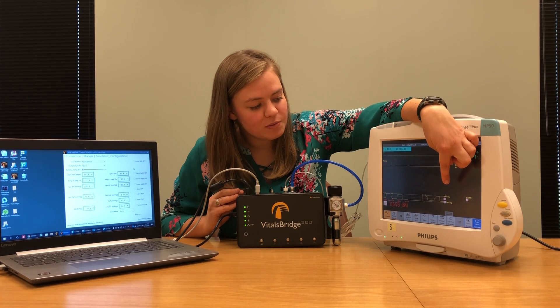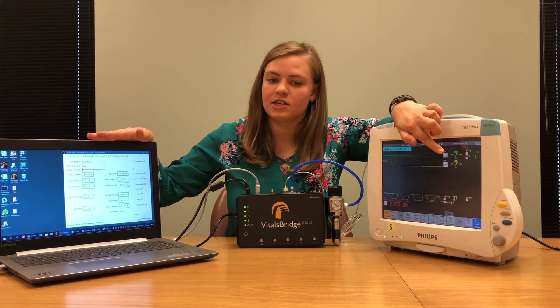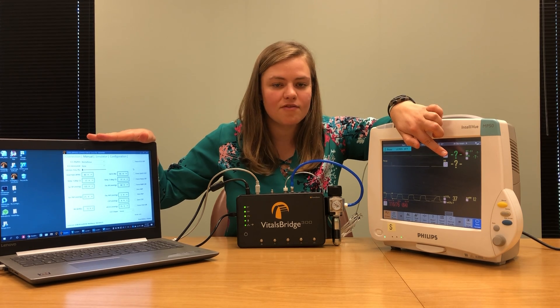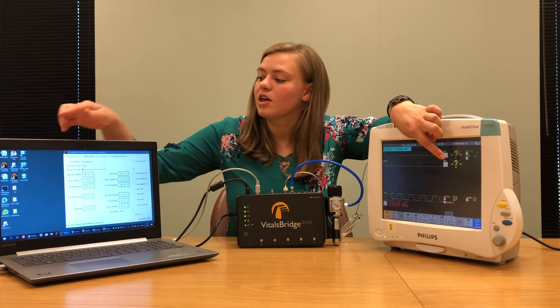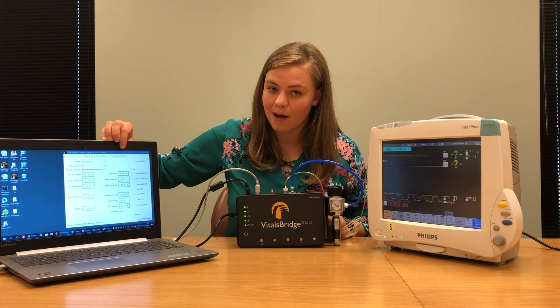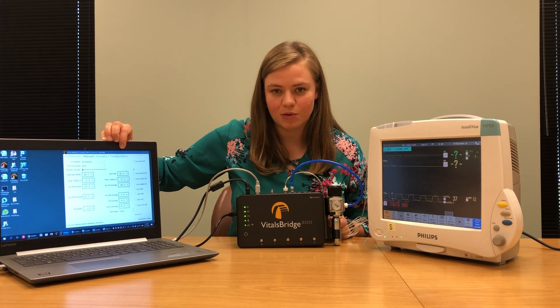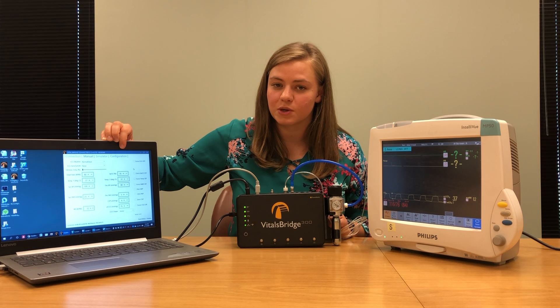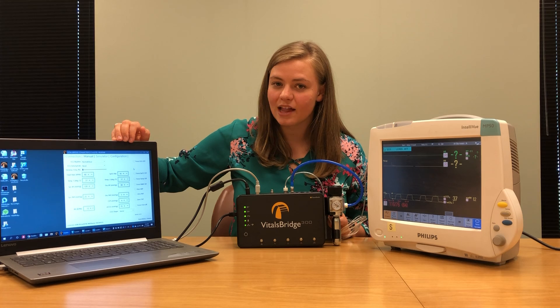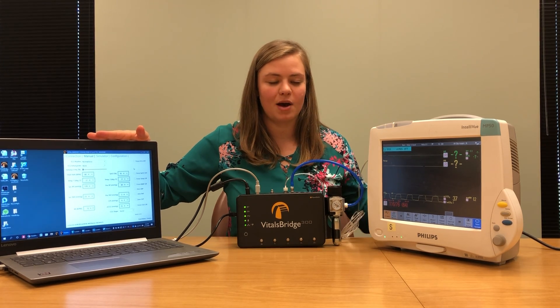After just a moment, you will also begin to see an ETCO2 reading. That ETCO2 reading should match the ETCO2 reading you put in on your VitalsBridge software. If after about five minutes those two numbers don't match closely, go to the configuration tab in your VitalsBridge connector software and perform a carbon dioxide calibration. Instructions can be found on VitalsBridge.com/downloads. Once calibrated, your ETCO2 on the connector software and on your patient monitor should match.